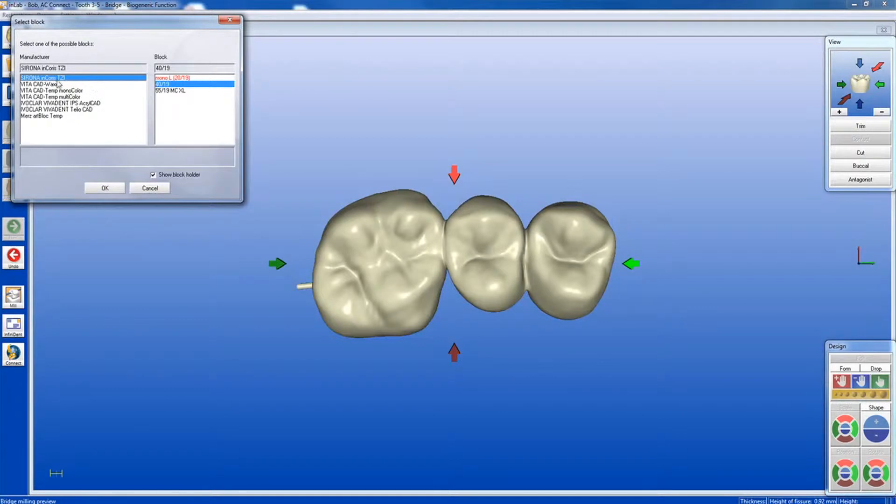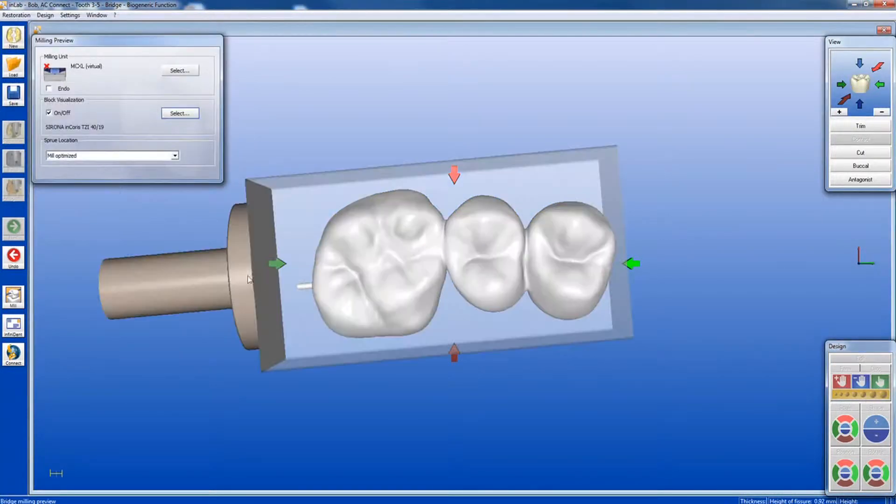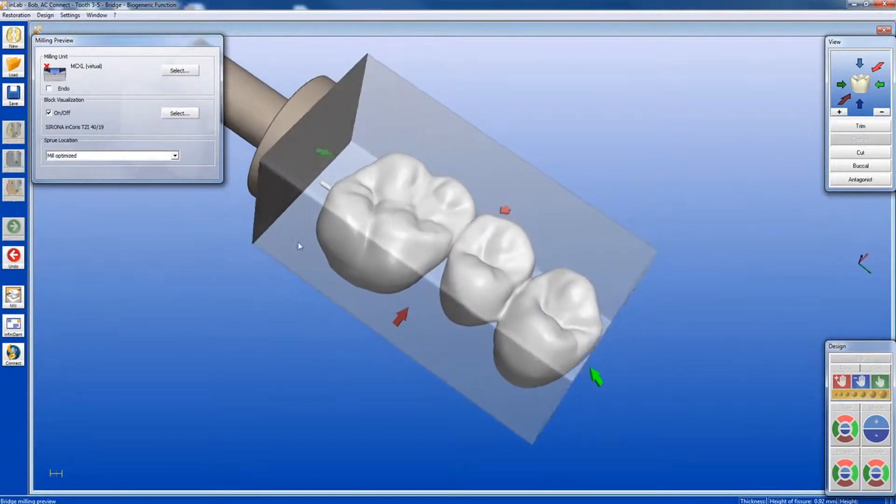Choose Sirona Inchorus TZI and select Block Size. Inchorus TZI is available in block sizes 2019 and 4019.